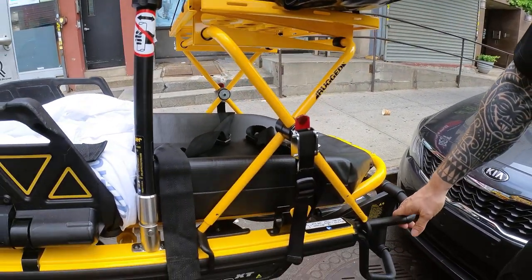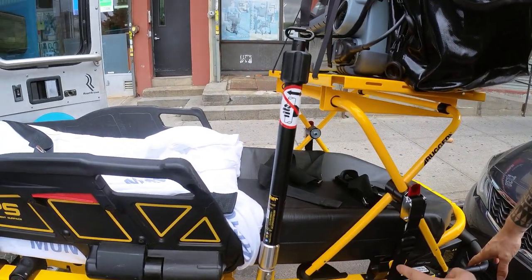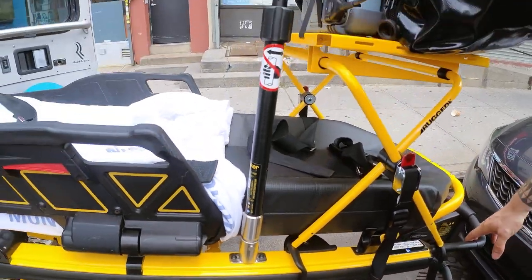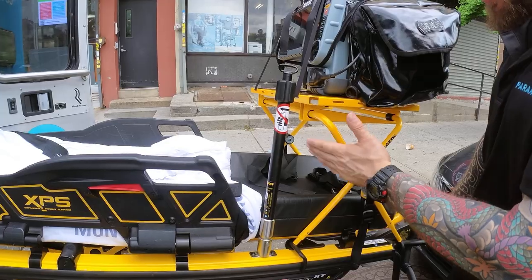This is how we transport. Very important: the IV pole must be brought up to secure properly — if the pole is down it will be in the way of proper securement. This is how we transport the patient and utilize this platform.